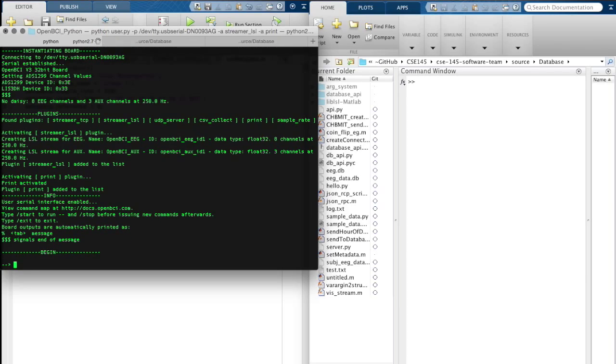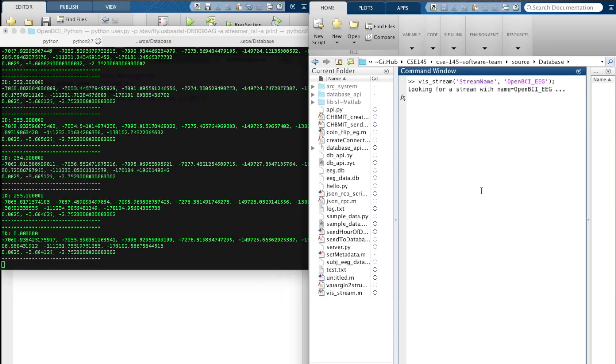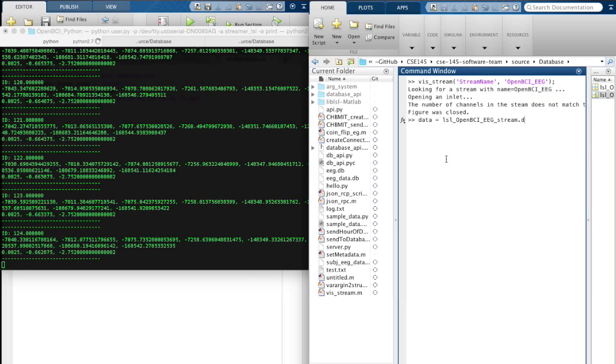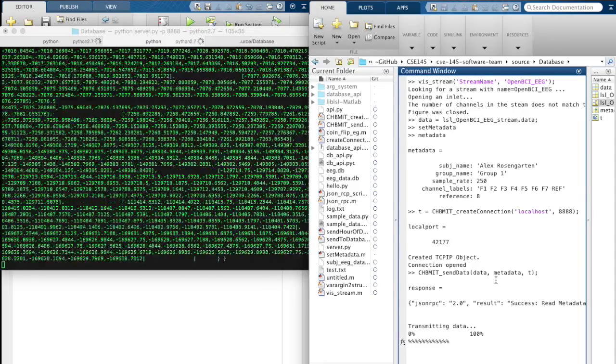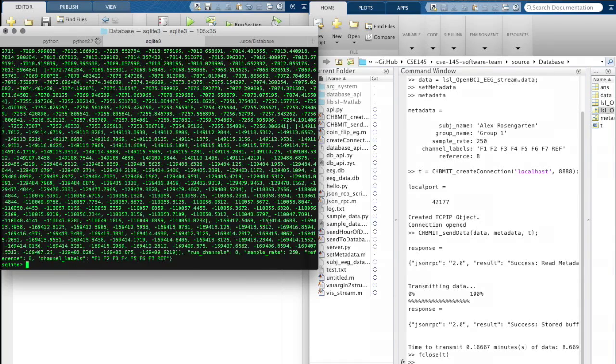An important milestone that we accomplished is setting up a data storage method in the cloud so that we can collect important patient data we can share with doctors, in addition that we can use for our own analysis in creating a seizure prediction system later on. Our database is set up to be variable so that if we want to include extra information later that we find useful while recording data, we can easily add that information without losing any previously accomplished data. So that database is set up so that on the event of the detection of a seizure, we'll send a buffer of about 20 or 30 minutes of seizure data into the database. This happens automatically. And this will be really integral to our analysis and understanding the disease and how we can predict when it's going to occur.